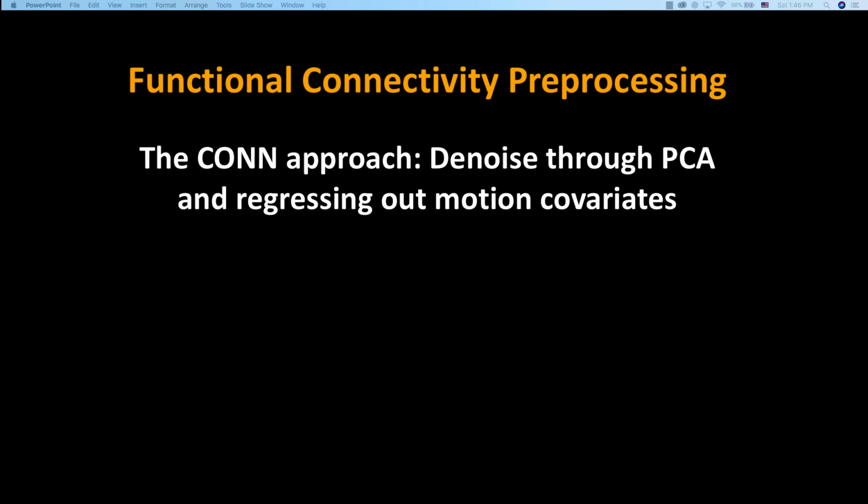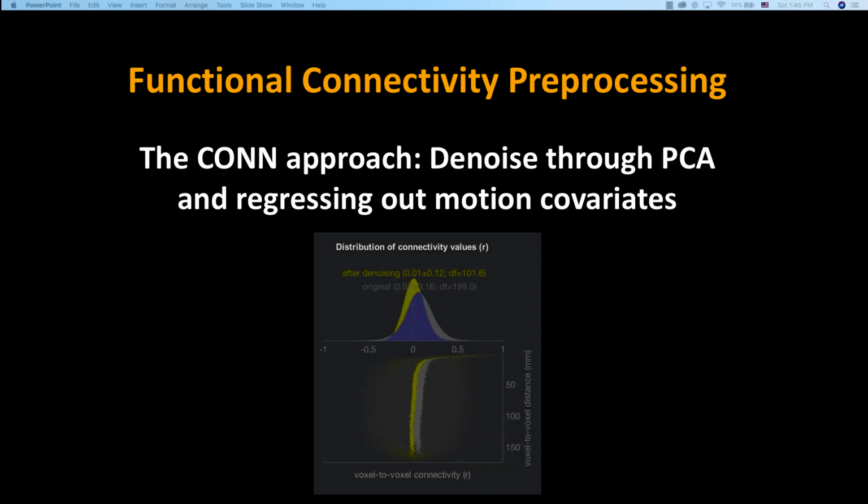So extract multiple components and filter all of those out of the gray matter, you get a more refined signal out of that. That's called aCompCor, which stands for anatomical component something. Name escapes me now, but that's the basic idea. And it also regresses out motion covariates. It does scrubbing and all that.